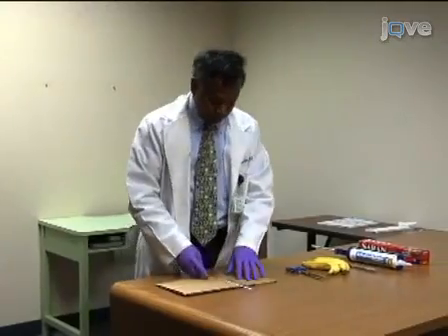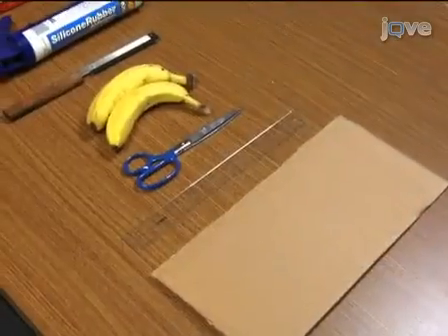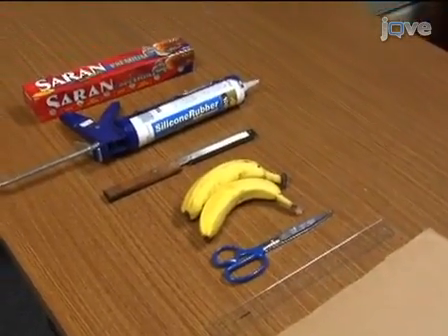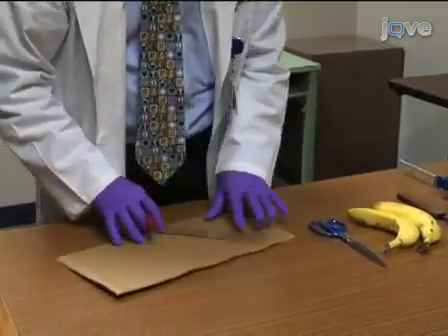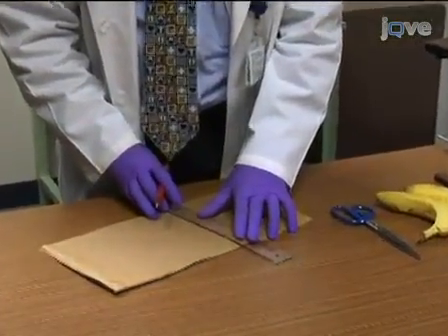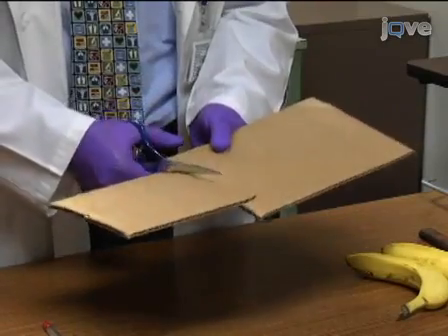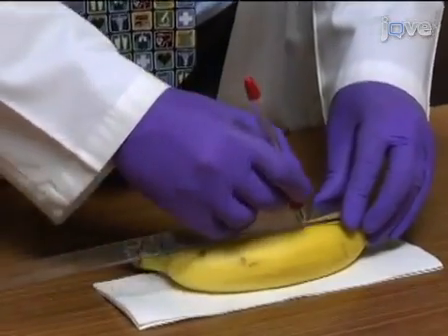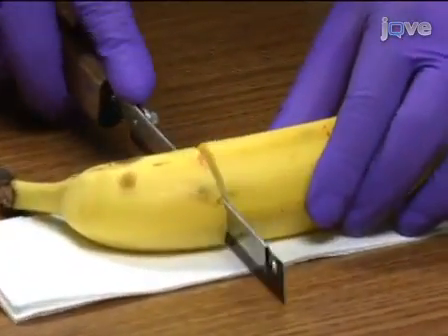Prepare the phantom lesion 1 or 2 days before your anticipated FNAB practice session. Before you start, have ready on the bench a piece of cardboard, a caulking gun, an unpeeled banana, and saran wrap. The first step in preparing a phantom lesion is to cut a 6 by 6 inch piece of cardboard to serve as the base plate. Next, cut a segment of banana approximately 2 inches long, which will serve as the phantom lesion core.